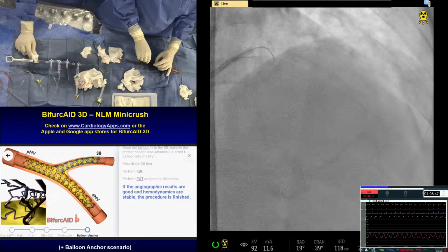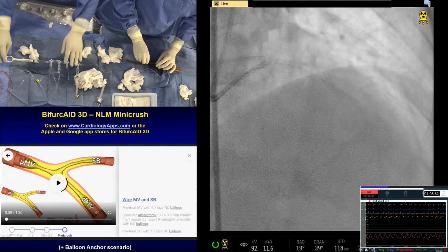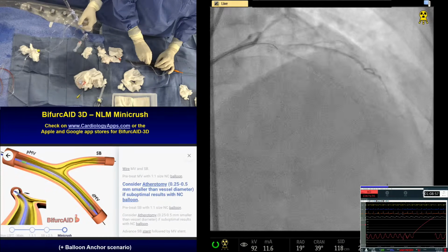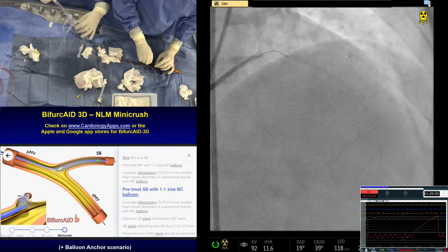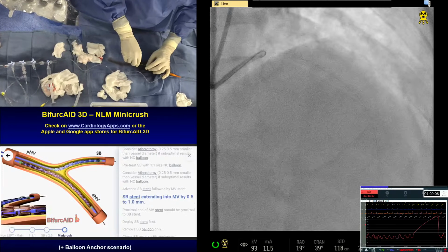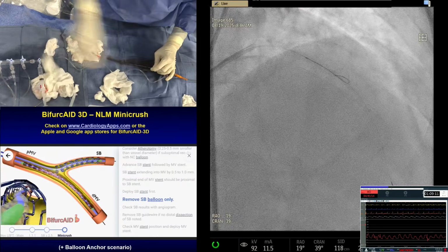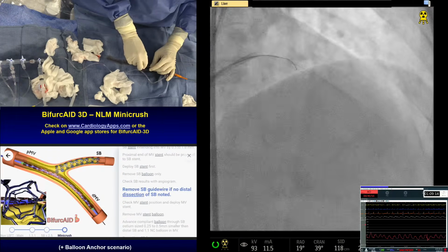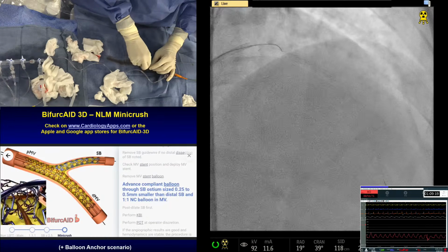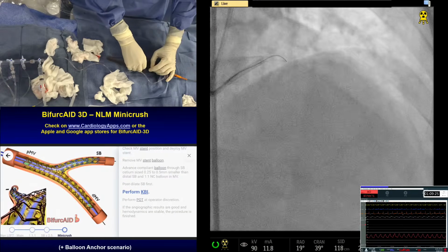Going in the circ. Okay, now what? I think the left main. Okay, now I advanced the wire, since the guide was not fully engaged. Go further and then pull back. So that is one thing people believe POT avoids. Now we have seen sometimes you cannot get a wire into the side branch. At that time you bring a balloon and open the struts at that level. High pressure definitely will open your struts.